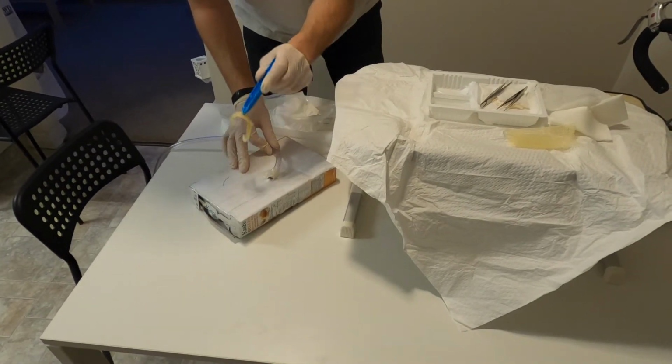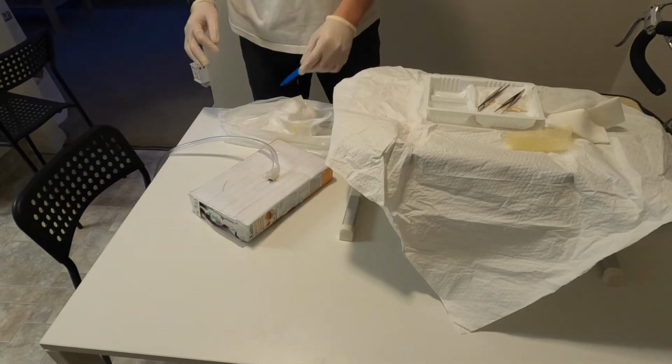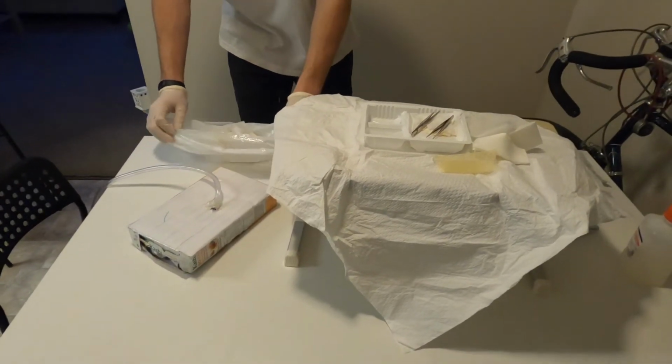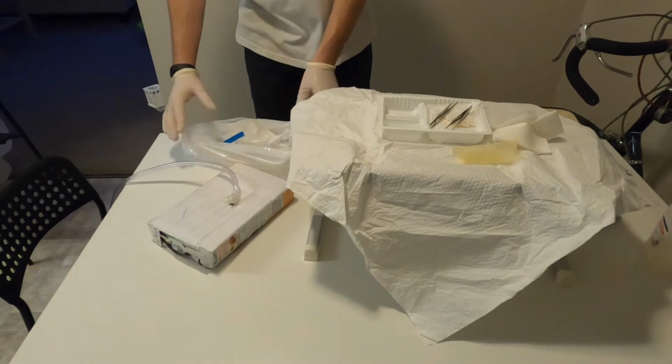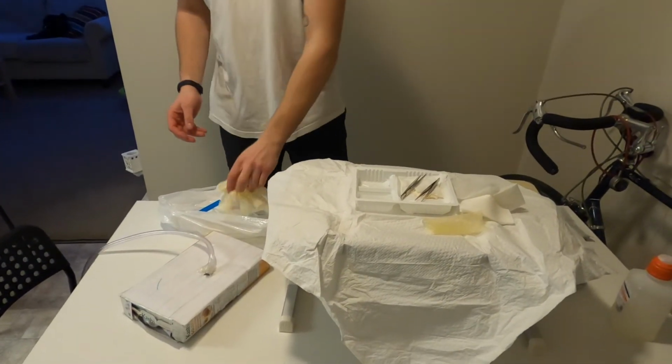Take it off like this. Right on. Okay. Drop that in there. Drop the forceps in there as well. And I can take my clean gloves off here. So next thing I'm going to do is don my sterile gloves.